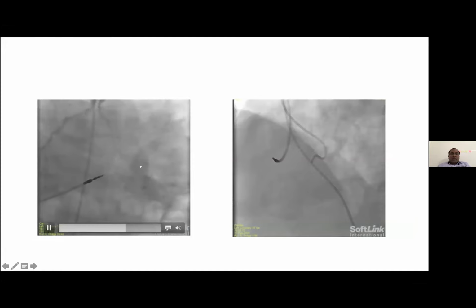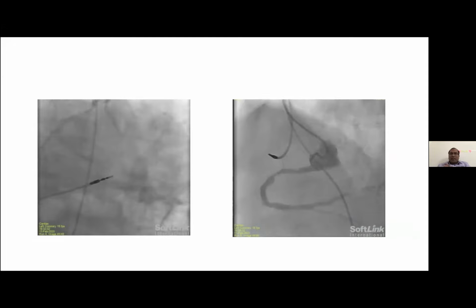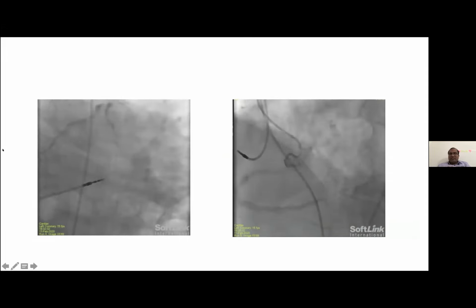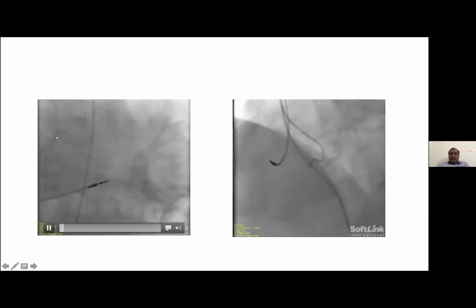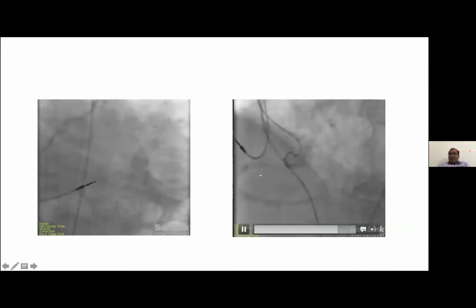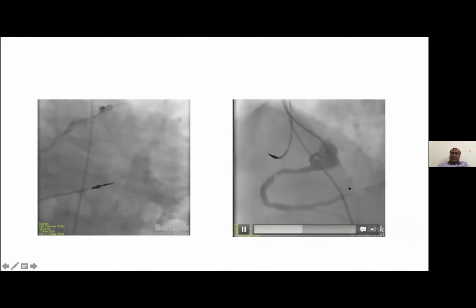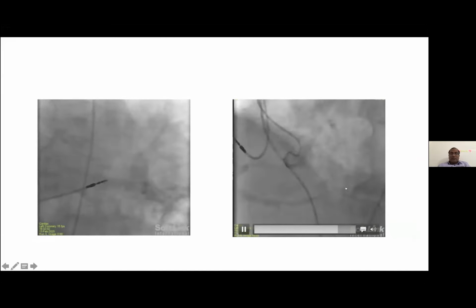The coronary angiography. Since we knew the anatomy of the particular patient from the outside cath, we didn't take multiple shots. We just confirmed the left coronary artery anatomy. We found a very tight distal left main disease, a 111 lesion, with a 70-80% lesion in the proximal RCA and a tight 80-90% lesion in the AV continuation vessel of the right side.